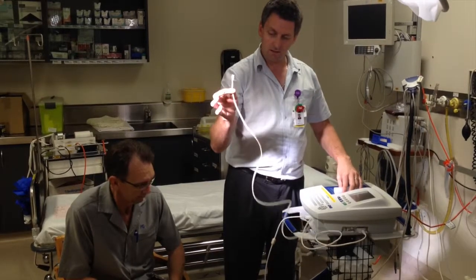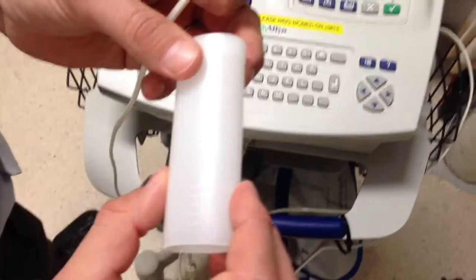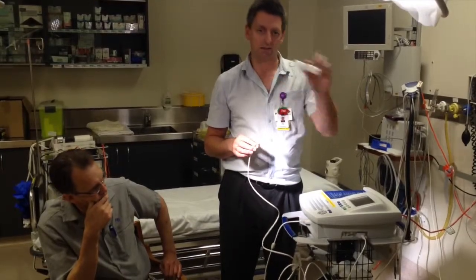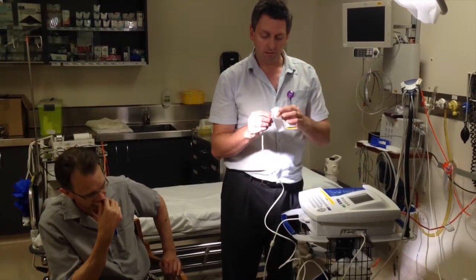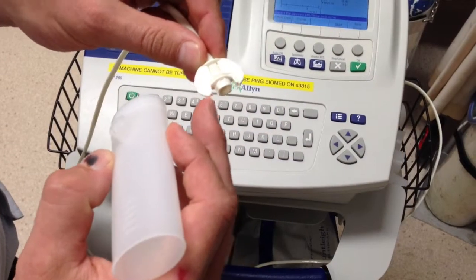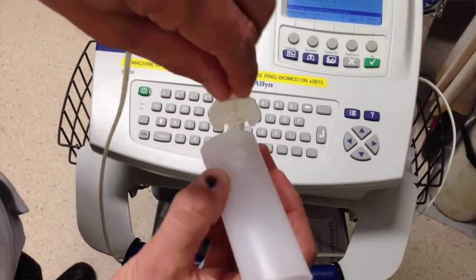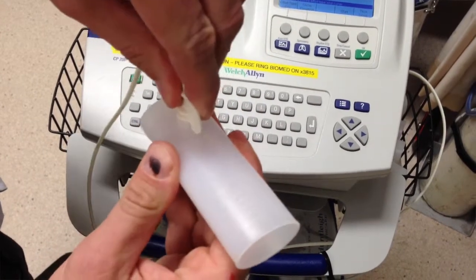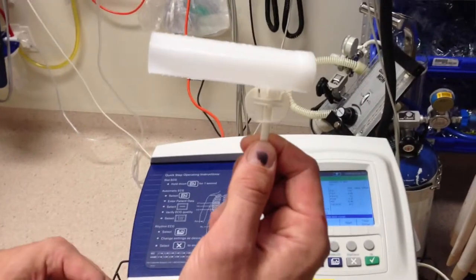We need the tubing that goes to the Welch Allyn machine, and we also need a disposable mouthpiece — it's for single person use only, and after that person's finished with it, it gets discarded. Do not mix between people. There's a little connector with flanged wings that goes into a little port at the bottom of the mouthpiece. Put it on straight and then twist it 90 degrees until it clicks, and then it sits securely so the wings go in the same direction as the mouthpiece.